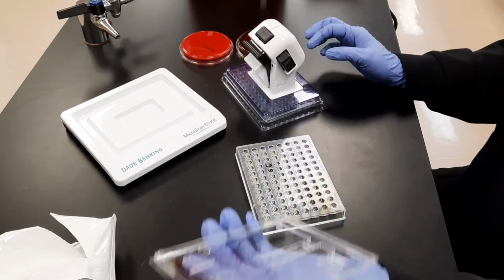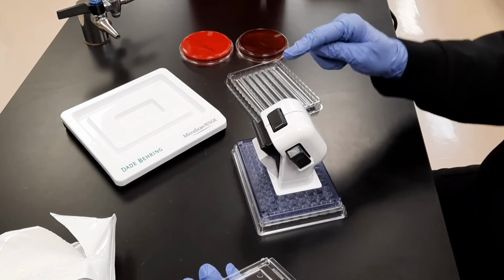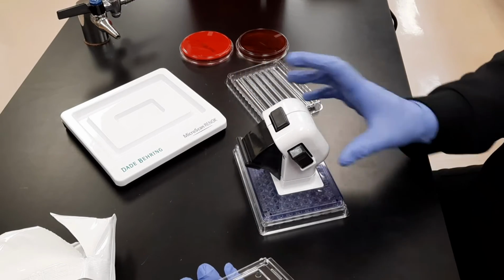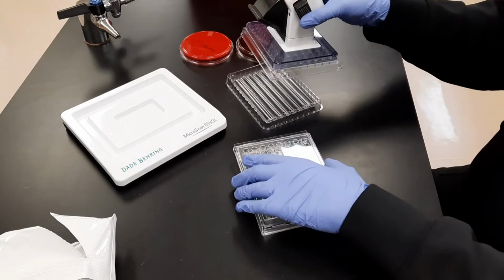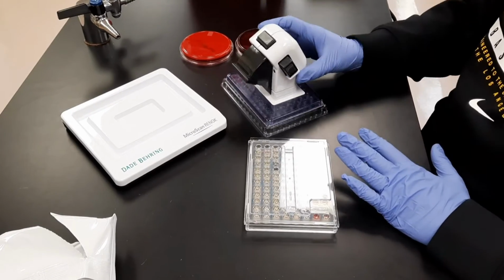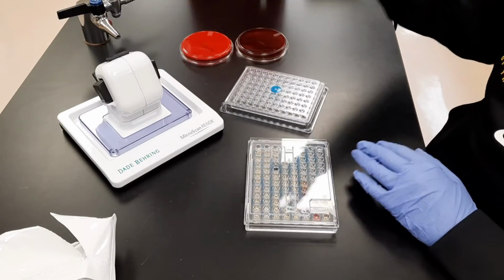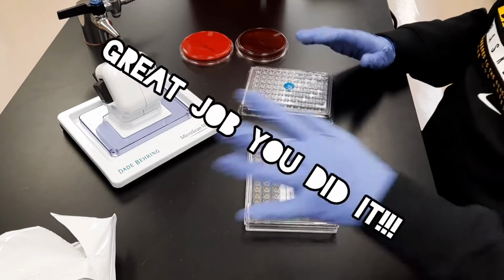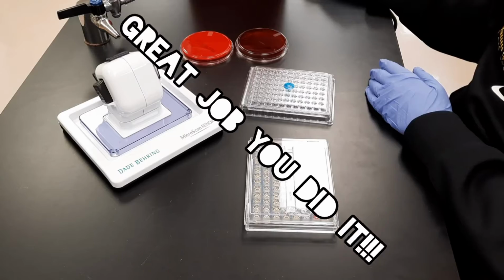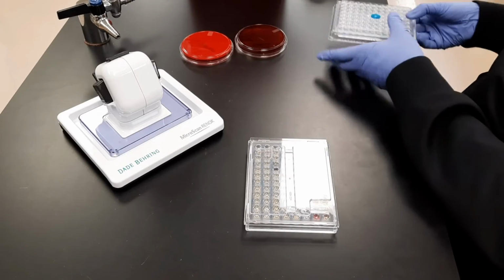Pick up the RENOK with the transfer lid attached, holding it level, and position the transfer lid onto the MicroScan panel. Depress the center release button. Lift straight up, put the lid back on, and depress the side levers. Make sure to dispose of the seed tray in an appropriate container.